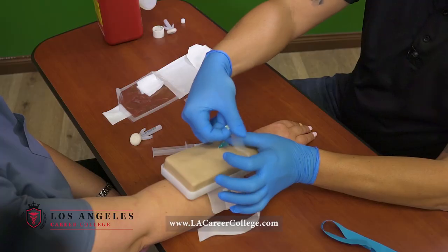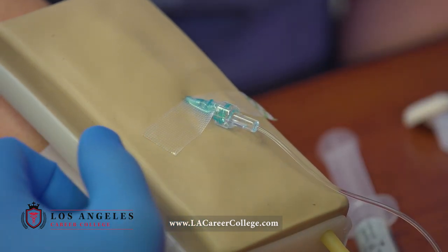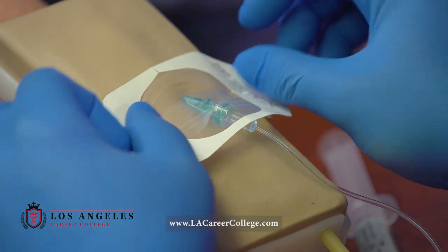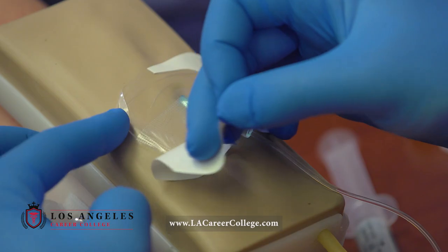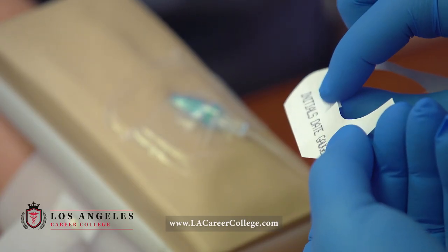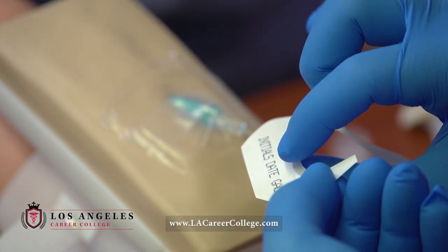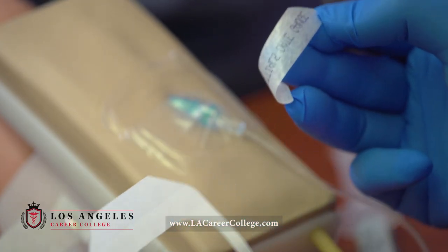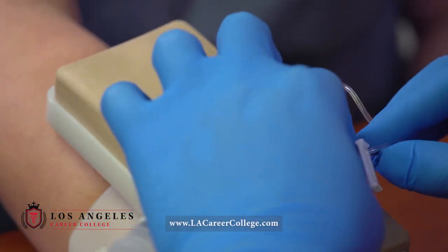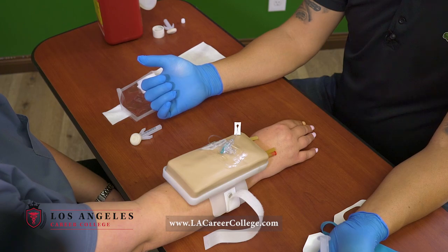So at this point, I'm going to go ahead and secure my line. Make sure when you're placing tape, you do not place the tape over the insertion site. Now that my IV line is secured, I will grab my Tegaderm and place it on my IV site to secure it. At this point in time, you want to put your initials, today's date, and gauge — this is a 22 gauge. I will clamp my IV side just like this. Place it right over here and remove the normal saline. Task complete.